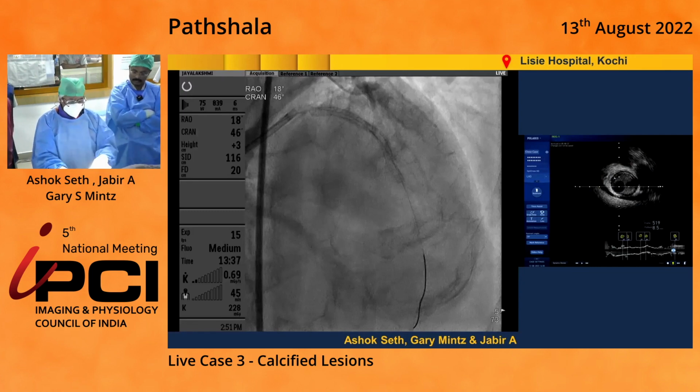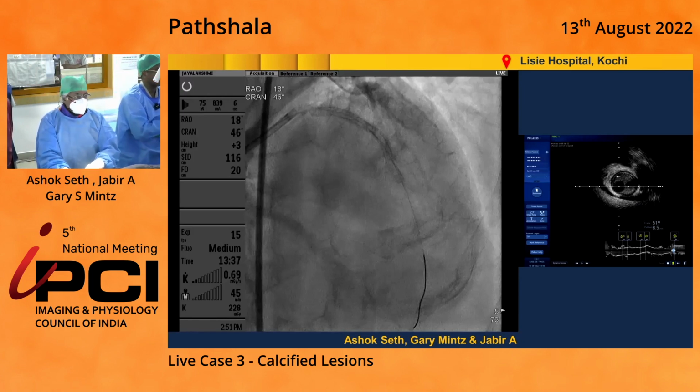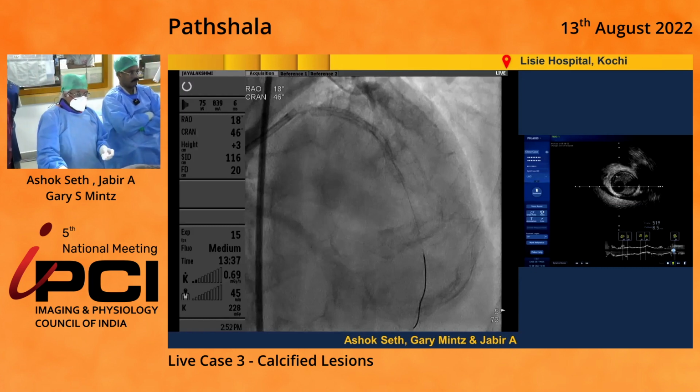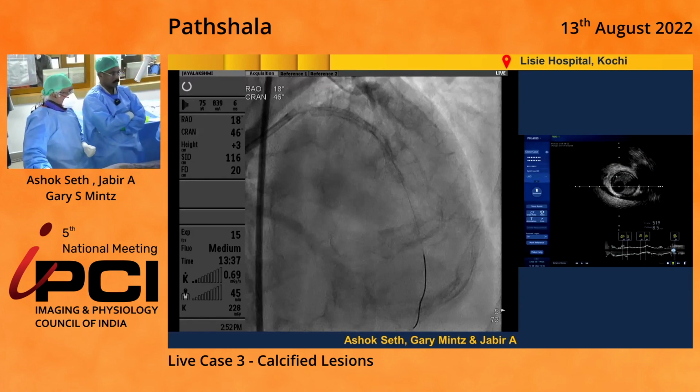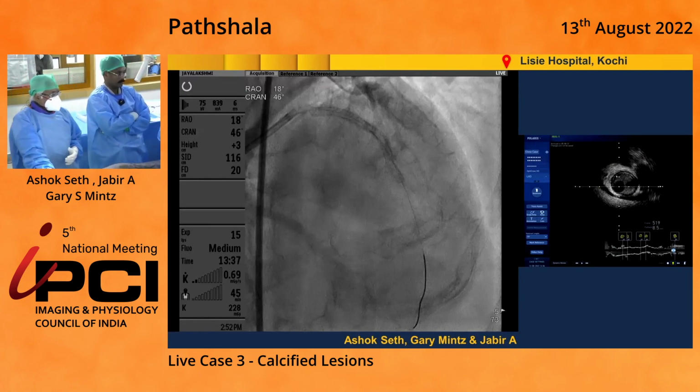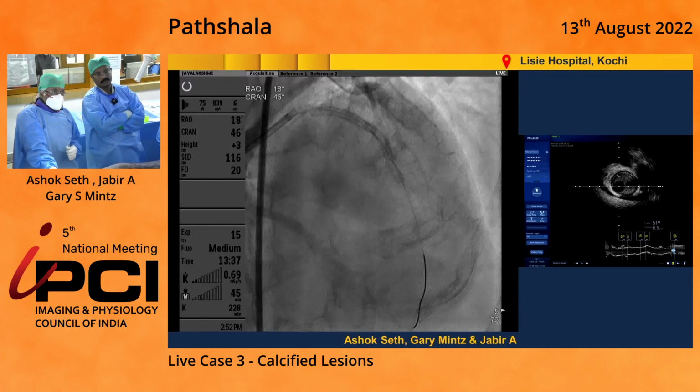So all we're looking at is the stent itself, and is that the cause of repeated thrombosis? As you can see, it's happening at the same point of the stent overlap, and therefore that is our area of interest. And certainly there's a residual stenosis in the proximal part, which is the index lesion from which the primary occurred. And Gary, over to you to define what we see on imaging for this stent and the vessel.